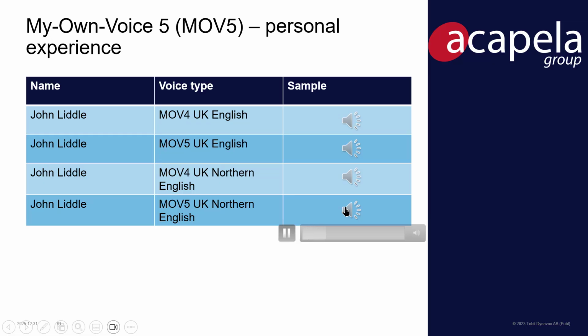He took a fast bus to go home and have a bath after slipping on the grass. My Own Voice 5 Northern English.